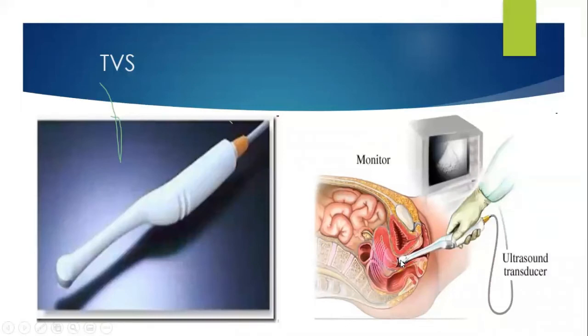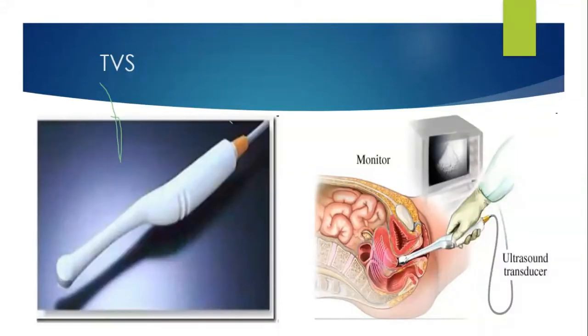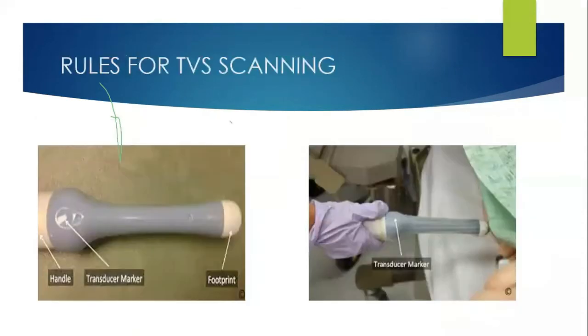Second, you can also do a mobility check. That means if you are a little suspicious that there are any endometrial patches in the uterosacral area and you are not able to find them on, let's say, routine ultrasound, then touching the probe here, in case it is eliciting pain, or in case there is a pyosalpinx or any other ectopic pregnancy, this transvaginal probe is very important to elicit the mobility as well as to check the sliding sign, also to look for any pain in this area.